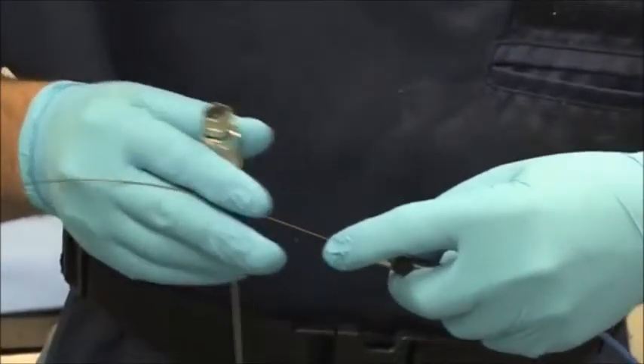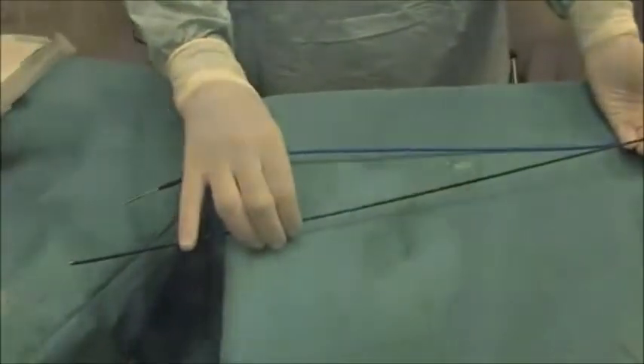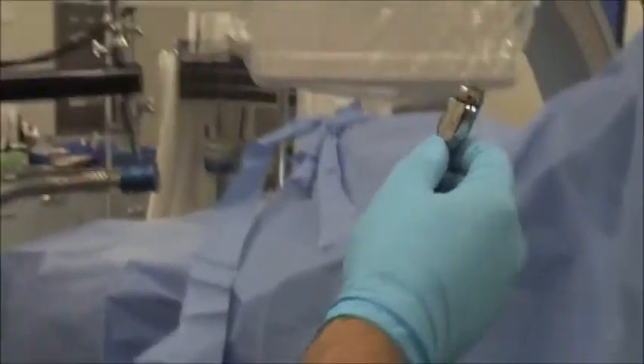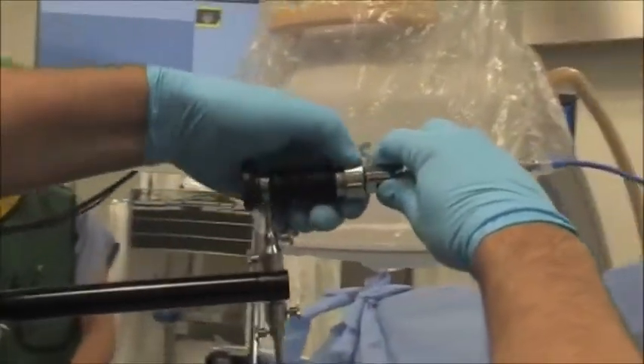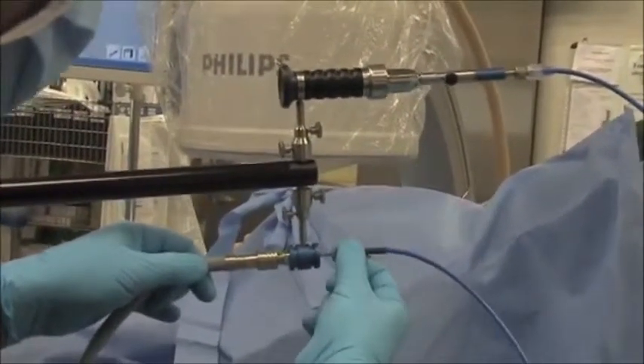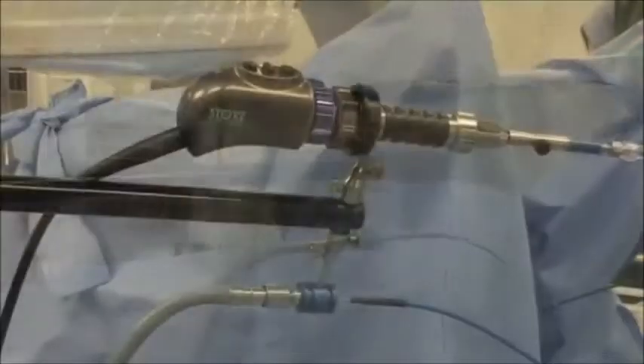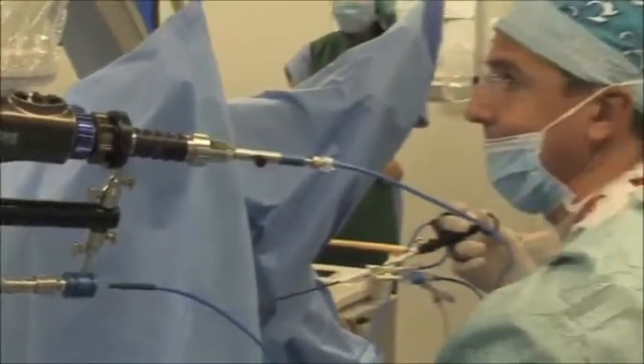With the catheter stretched out, the fiber optic is then inserted into the end of the blue optic protection tube. The body of the fiber optic is connected to the eyepiece with a turn. The light connector of the Poliscope is then inserted into the light adapter at the end of the three joint arm. The Poliscope is now ready for use.